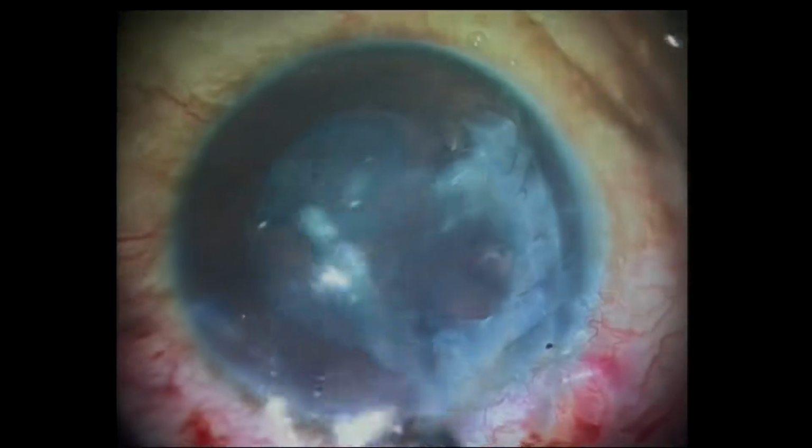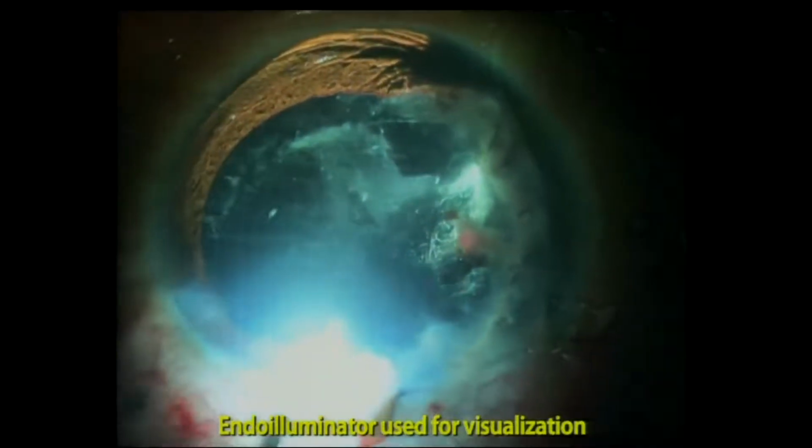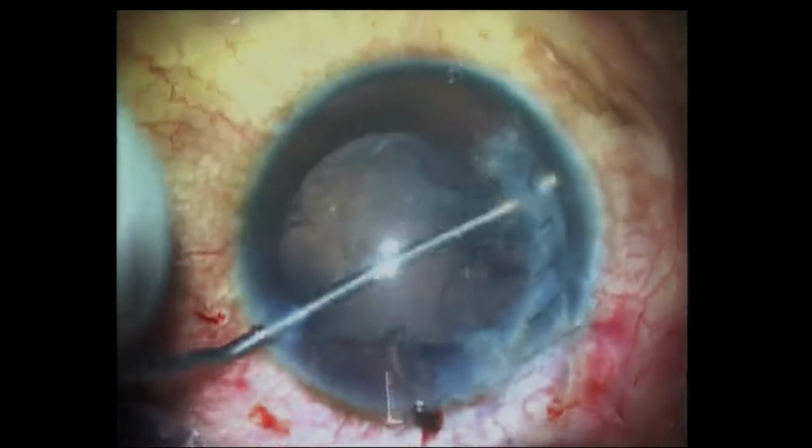It's a very milky kind of cataract, but you see the sheen on the bag is very, very abnormal, and it's abnormal because of the injury. And if you see over here, there is a straight fibrous band extending all the way from the bag to the corneal wound, and this is something that you will see in certain cases where there is already an attachment from the vitreous.